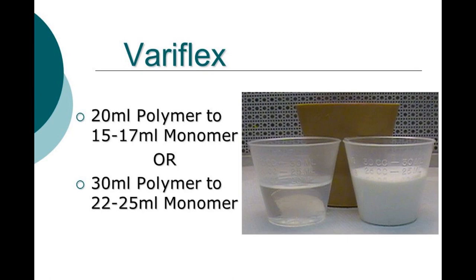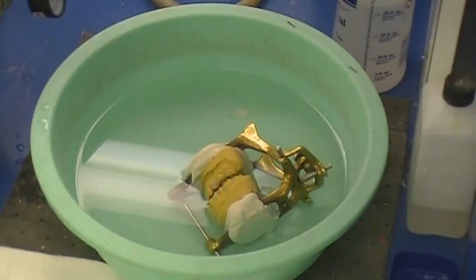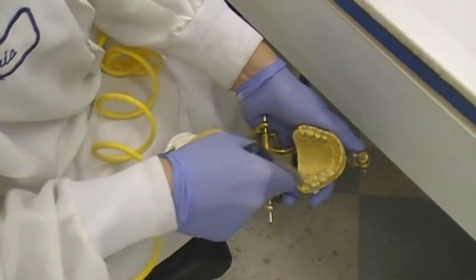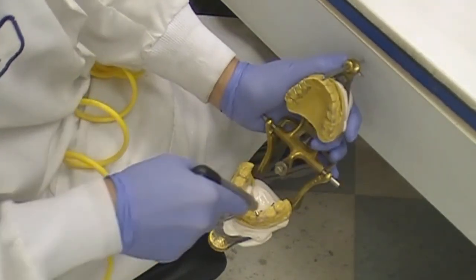A higher level of monomer is needed to absorb polymer beads, resulting in a clearer appliance. Models are soaked in cool tap water for 20 minutes. This is needed to push out air from within, as later models will be submerged in pressure pot water to cure acrylic. Excessive air in the model could affect quality of acrylic cure and adaptation. Remove models from water and evict surface moisture with an air gun.